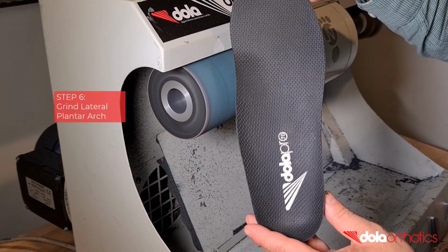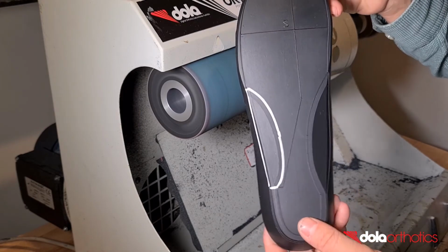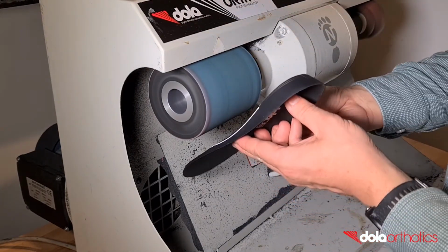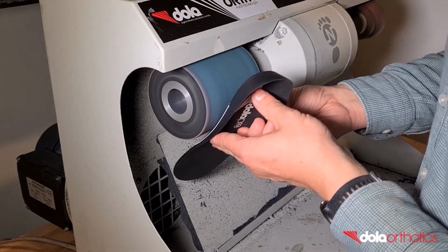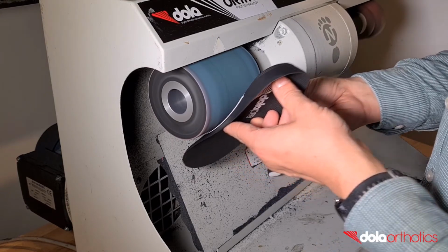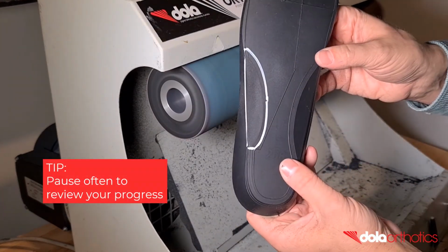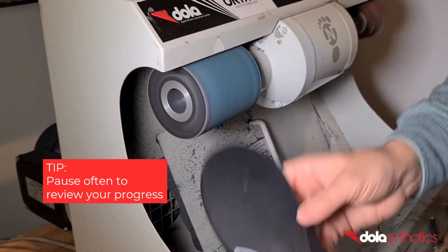The aim of grinding is to remove the orthotic shell material in your lateral grind area between your 2 guidelines. Hold the orthotic shell on the dorsal and plantar surfaces. Place the edge of your orthotic shell under the lateral longitudinal arch against the grinder. Remove small sections of the orthotic at a time until you become comfortable and check your progress against your guidelines.